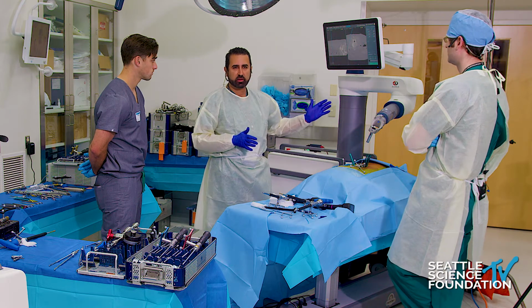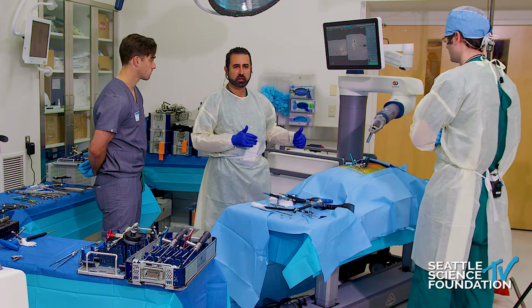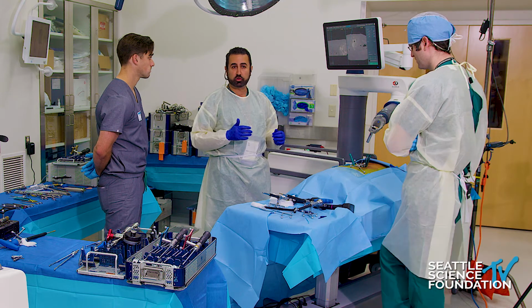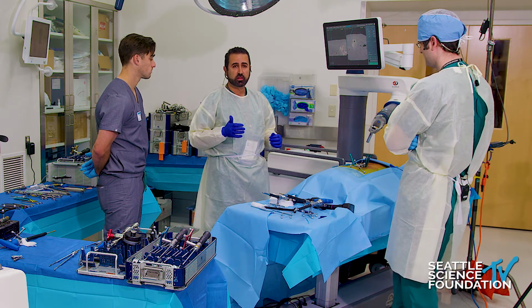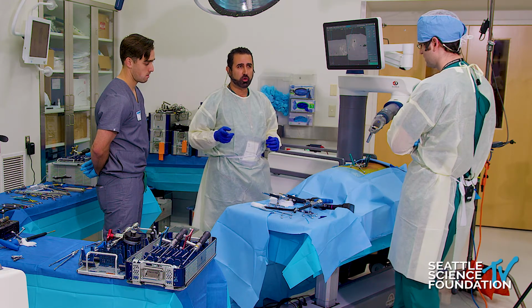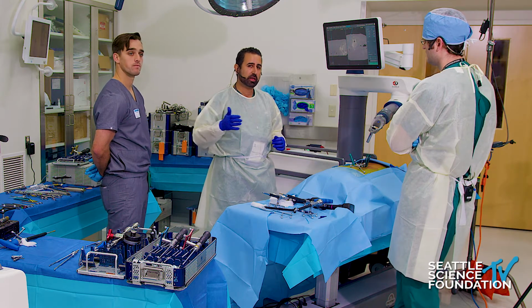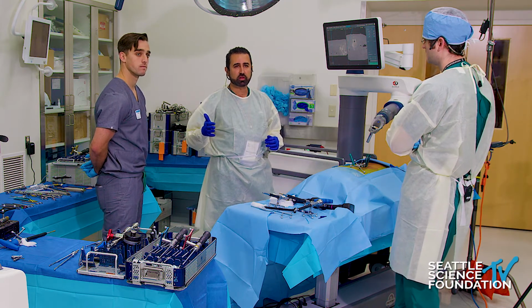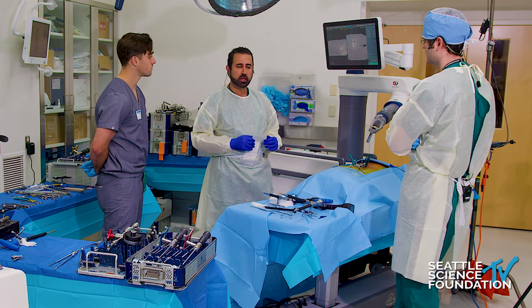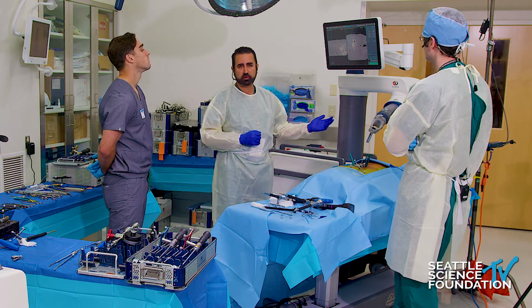I check again on the trajectory. I re-register my trajectory with the foot pedal. And if it's still not adequate or accurate for me, I replan the screw into a better position. And I think that the slight advantage of that is that compared to fluoro or a non-navigation-based solution where I'm pockmarking a lot of potential different pilot holes, and I've done this so many times, here I'm minimizing the number of pilot holes that I make based on a trajectory that I believe. And hopefully that means minimizing the skiving.